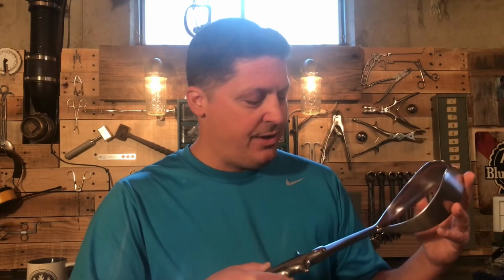Now these aren't used very much anymore. They've come out of favor over the past 30 years. In fact, I think they're used in about 1% of vaginal deliveries today on average. So they've really fallen out of favor, and there's different reasons and speculation as to why that is. Vacuum assisted delivery has become more common, and there's pros and cons to both methods of assisted vaginal deliveries.